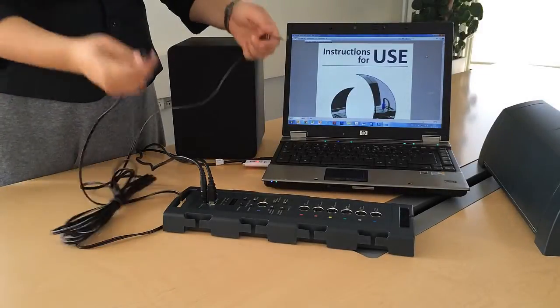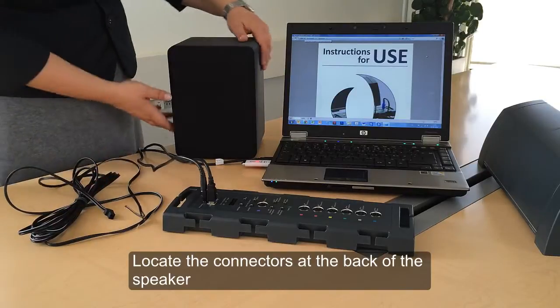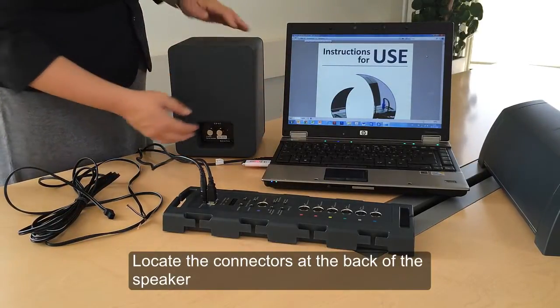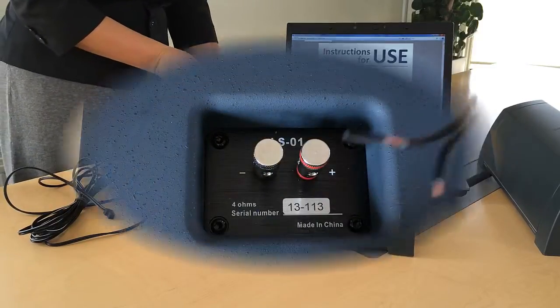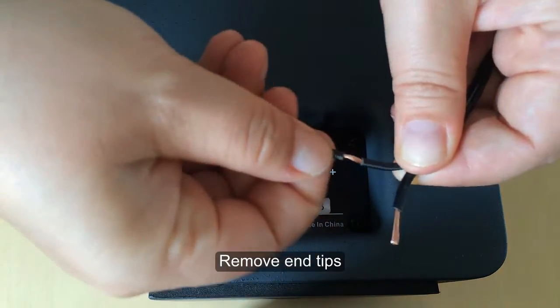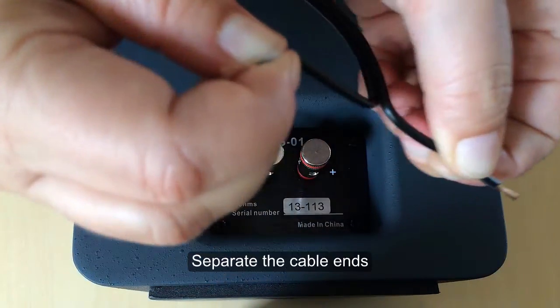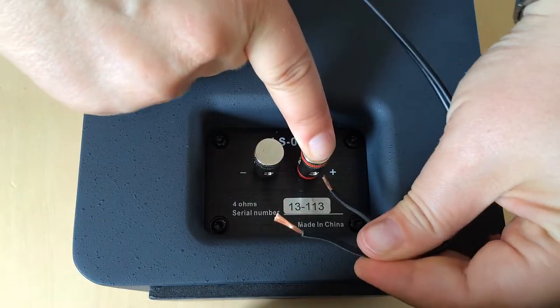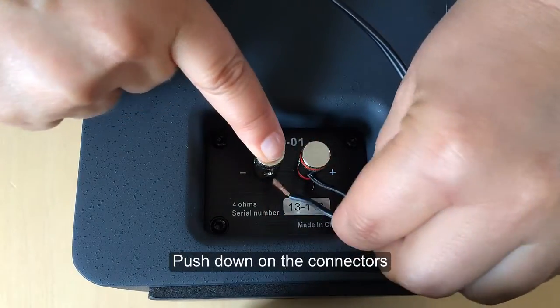Let's take a look at how to connect the speaker cable to the speaker. Find the connectors at the back of the speaker. Remove the plastic coverings from the cables and separate them a short way. Connect the cable to the connectors by pushing them down and slotting the wires in.